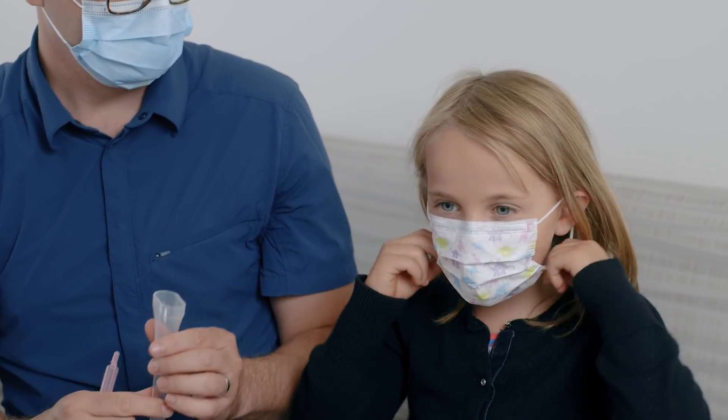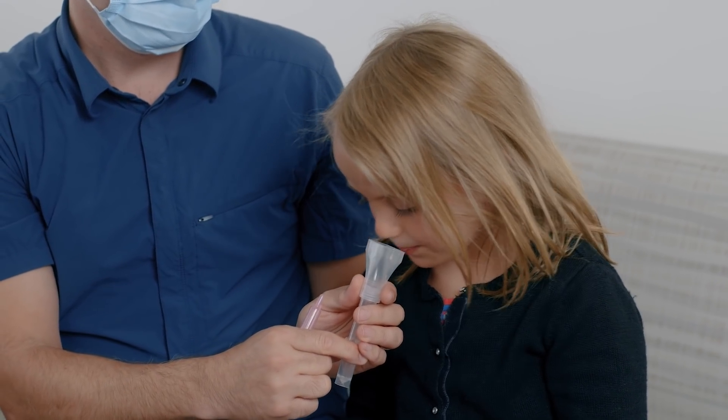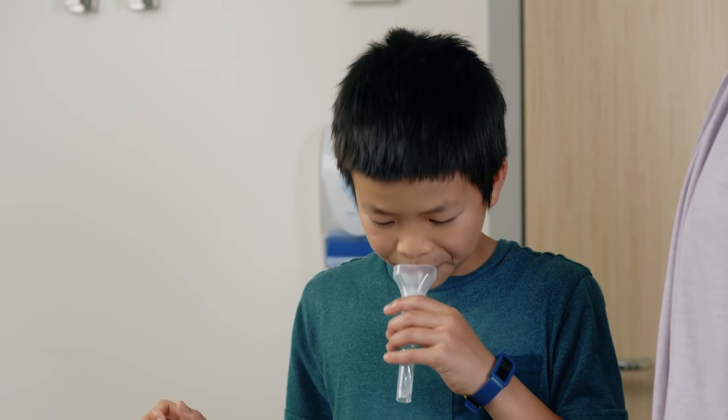Younger children can spit the salty water into the funnel-shaped container held by the caregiver. Older children can carefully spit into the container on their own.